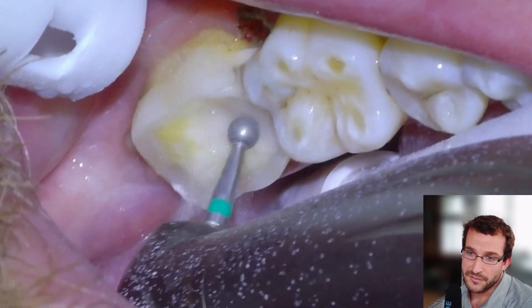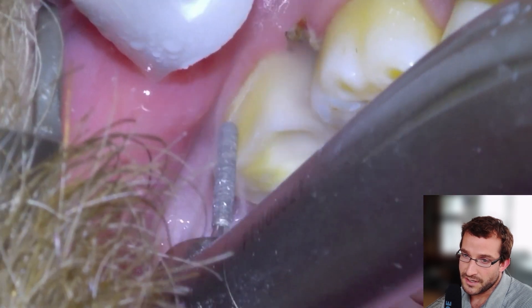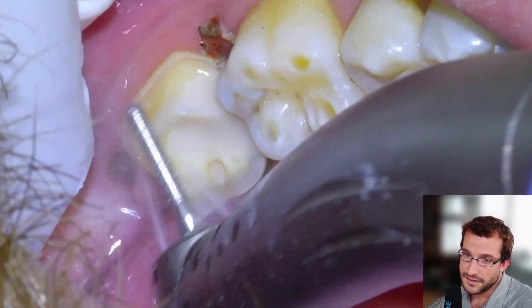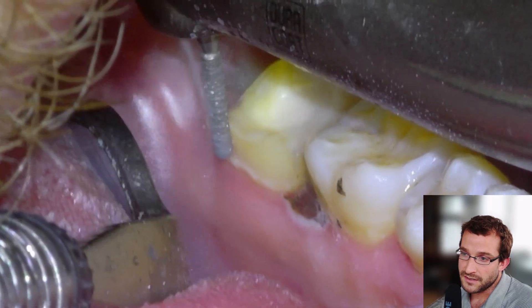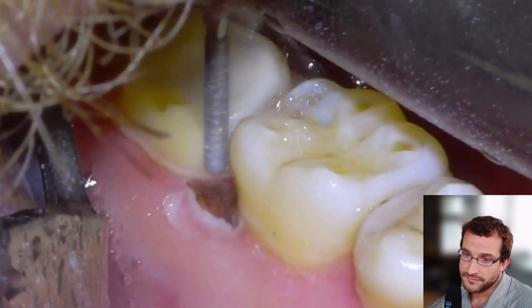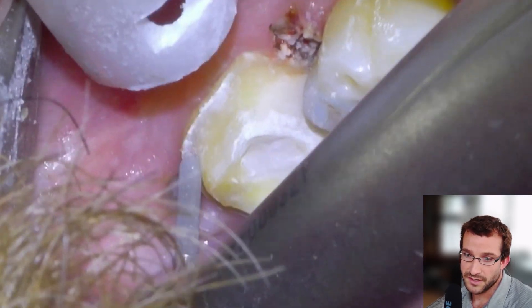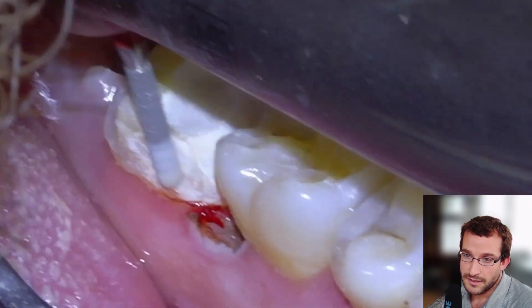Then we're going to do a quick crown prep. We pretty much have already done our occlusal reduction, so we're just going to take a fissure bur and trim the tooth axially so that we have a good clean margin. These are nice kinds of situations because you can tell the patient that the pain is going to go away right away after the procedure. We'll do our lingual reduction, and there's the mesial margin where we removed the gum tissue with the electrocautery tip.